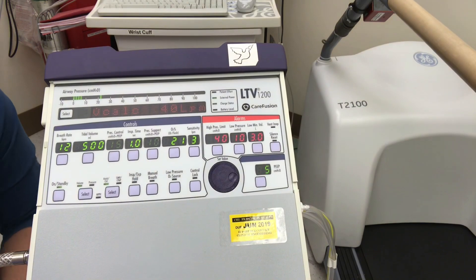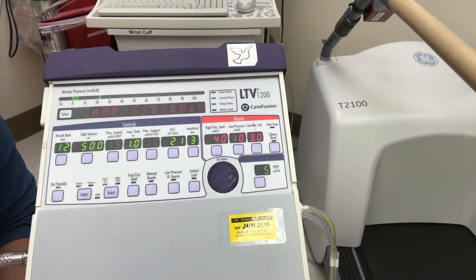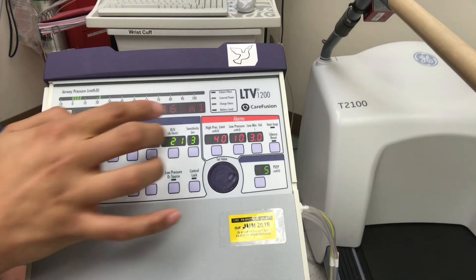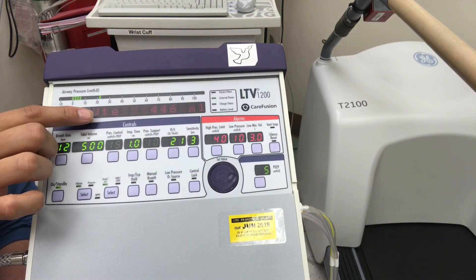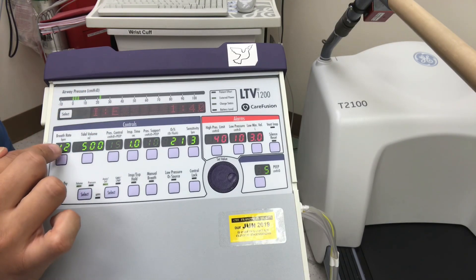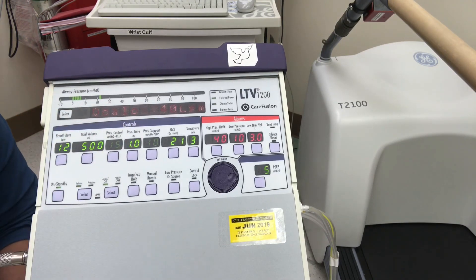Now let's look at our vent settings by toggling through the menu. We have MAP — mean airway pressure — then PEEP as a reading of the dialed PEEP, then rate F which is frequency, then tidal volume exhale, then minute ventilation which is rate times tidal volume, and finally flow.